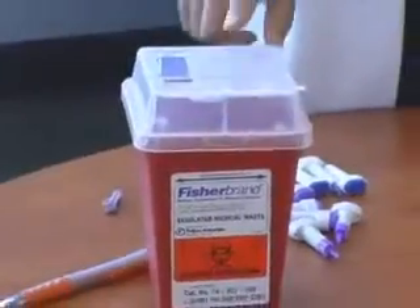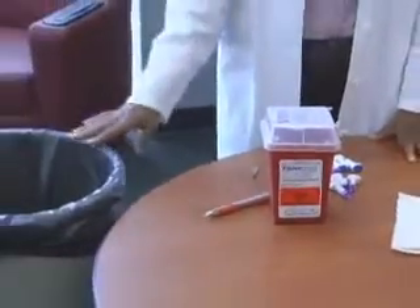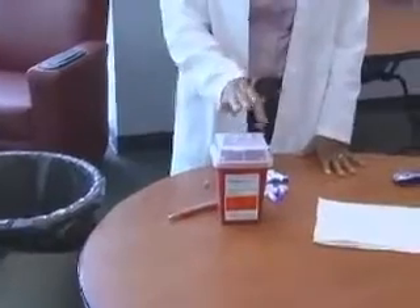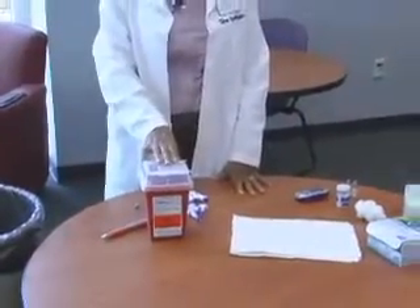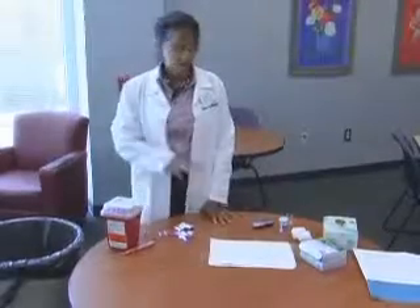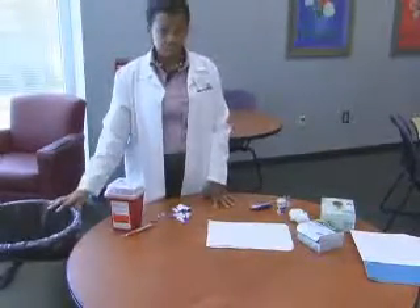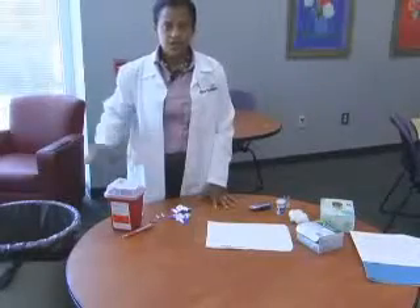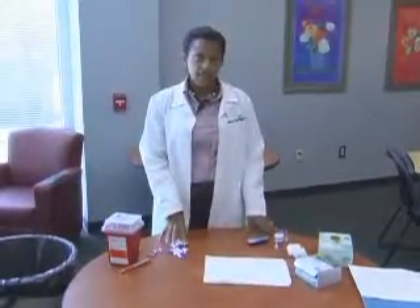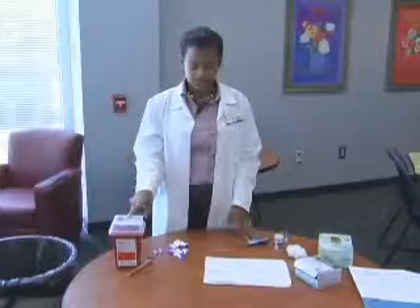Very importantly, you want a sharps container. This is where you should throw your used lancet devices. You also want a trash can nearby, because this is where you want to throw everything else besides your lancet devices. You don't want to throw gloves, cotton balls, and test strips in the sharps container — this trash is very expensive to dispose of. Notice how I have the table set up: I'm right-handed, so I have my sharps container and trash can right next to my right hand. Keep your work area clean, because this is how accidents and needle sticks happen. After you use your lancet, before you start to worry about running the test, throw the lancet immediately into the sharps container.